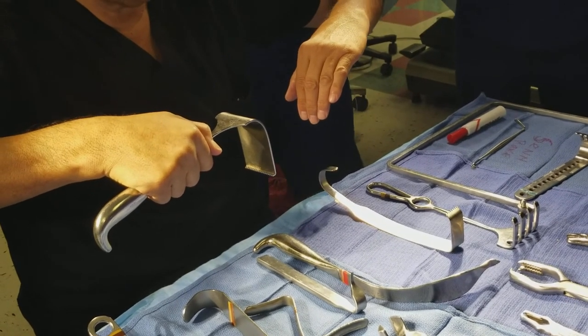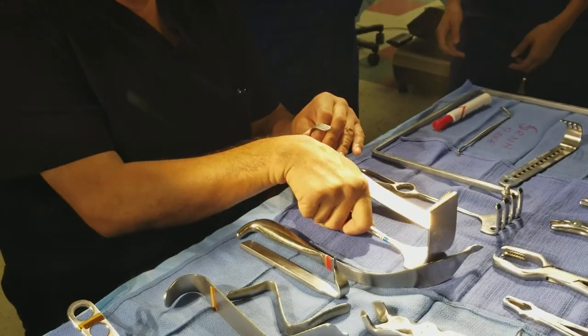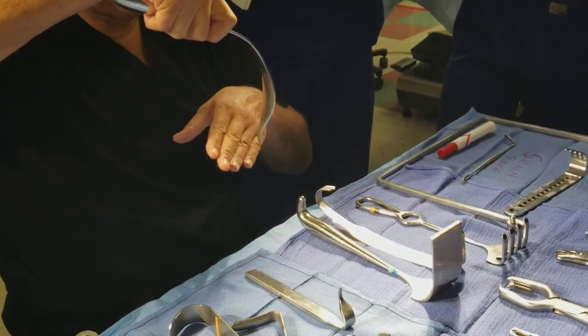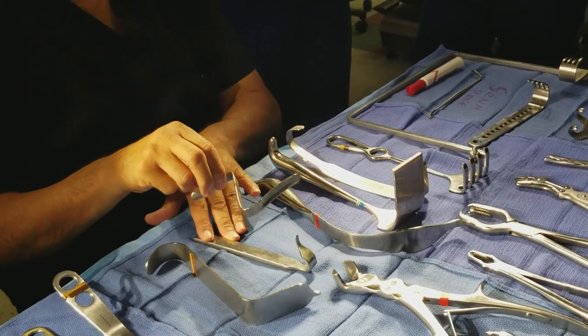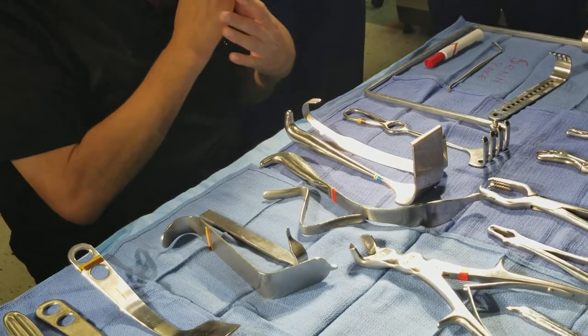Here's a myerding retractor — there are some thinner and narrower ones. You usually use two to retract tissue back to get into the bone. The myerding has a bunch of little fused teeth. There's also a cobra retractor that resembles a snake — again, to retract tissue back in hip surgery. And here's a Z-knee retractor, used in the knee for the ligaments during total knee replacement.